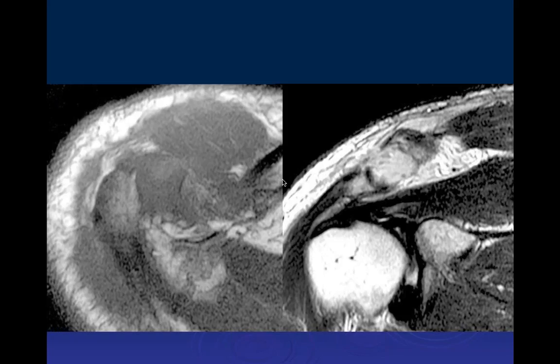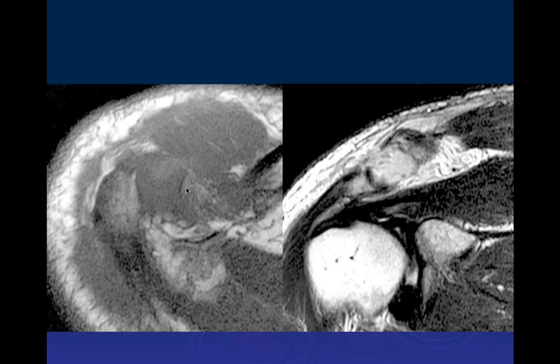So it looks like we've got a left T1 and on the right a coronal T2 of the shoulder. We're seeing some irregularity of the AC joint, and here the AC joint is widely separated on both the axial and coronal images.